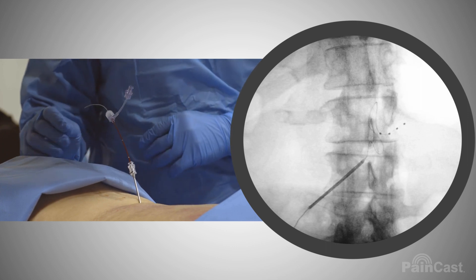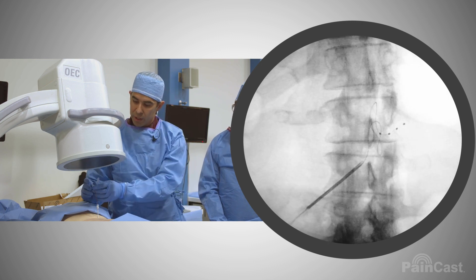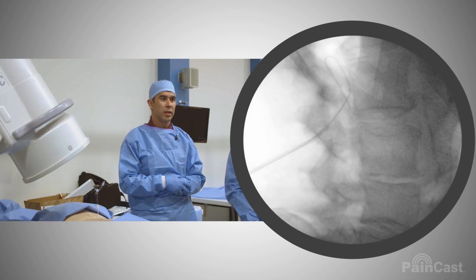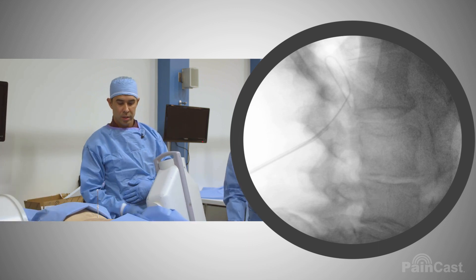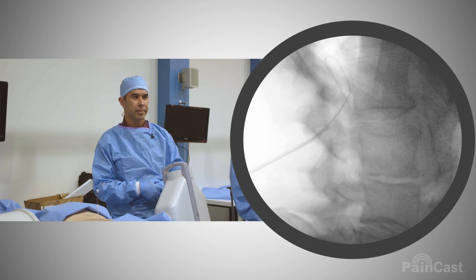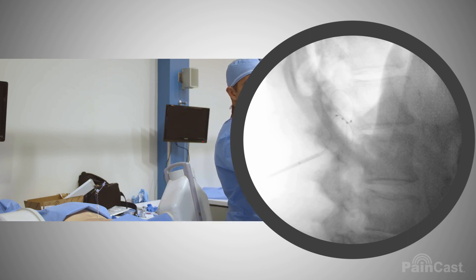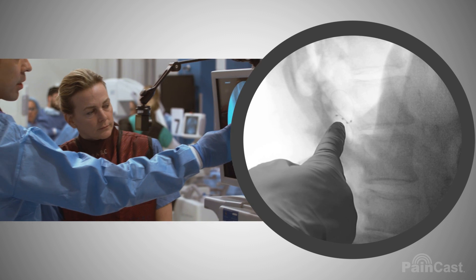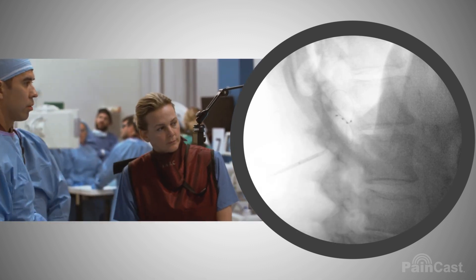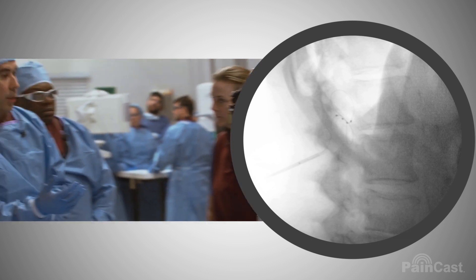It's got a nice little loop in there. Let's go lateral and see what it looks like. Here's our foramen — it actually looks like it's going backwards, but that's okay, because we could use any of these. The second and third contacts are the ones we'll use, as long as it's not going forward and coming down here, because then we're going to get the anterior nerve rootlet.